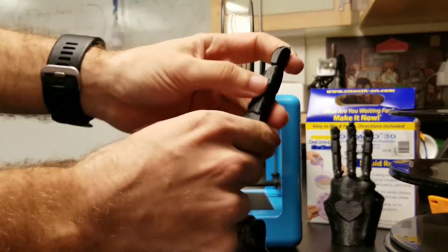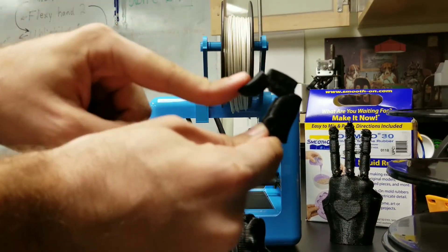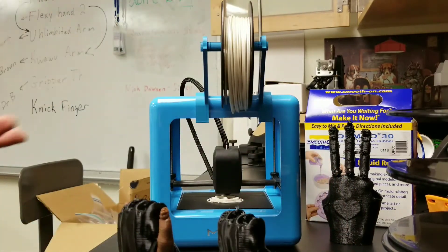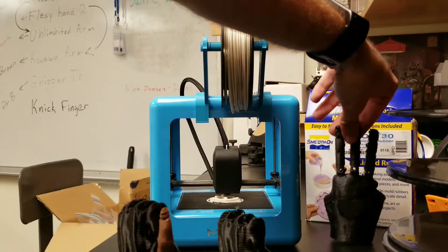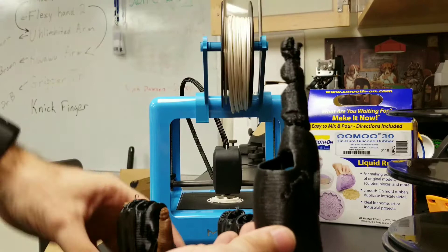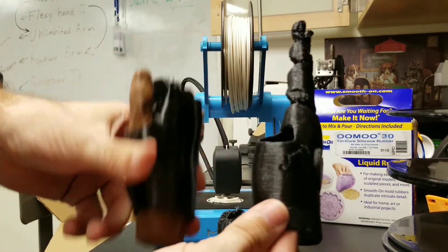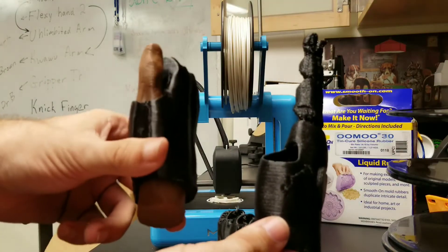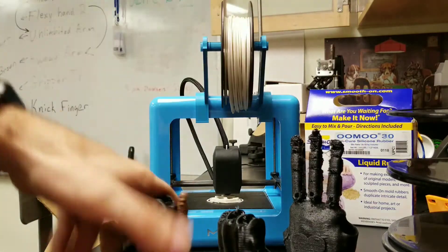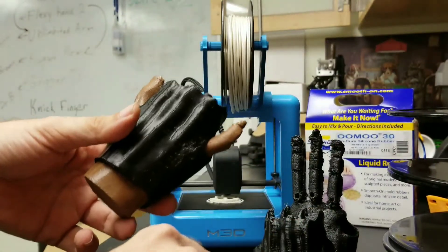It's very easy to print and prints very reliably — much easier than NinjaFlex, which requires a special extruder on something like our Lulzbot Taz. This is what we're getting out of the Lulzbot with NinjaFlex. So you can see the $200 printer is doing just as good, if not better, than the $2,500 Lulzbot that we have. I've kind of changed gears to do a modular hand that can have different attachment fingers.